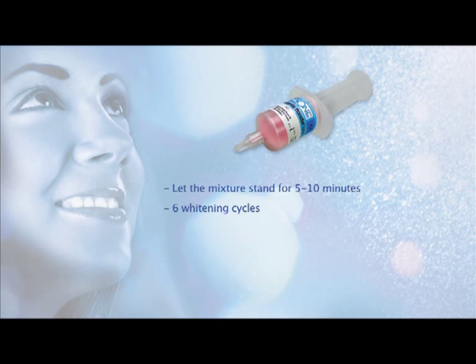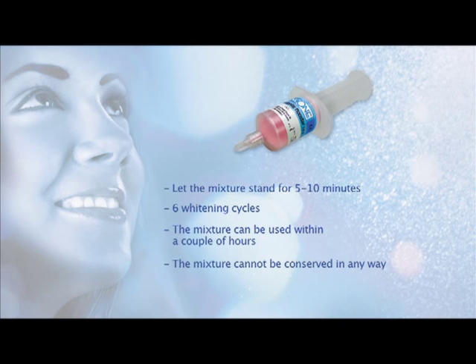There will be enough gel for six whitening cycles. The mixture can be used within a couple of hours and cannot be conserved in any way.